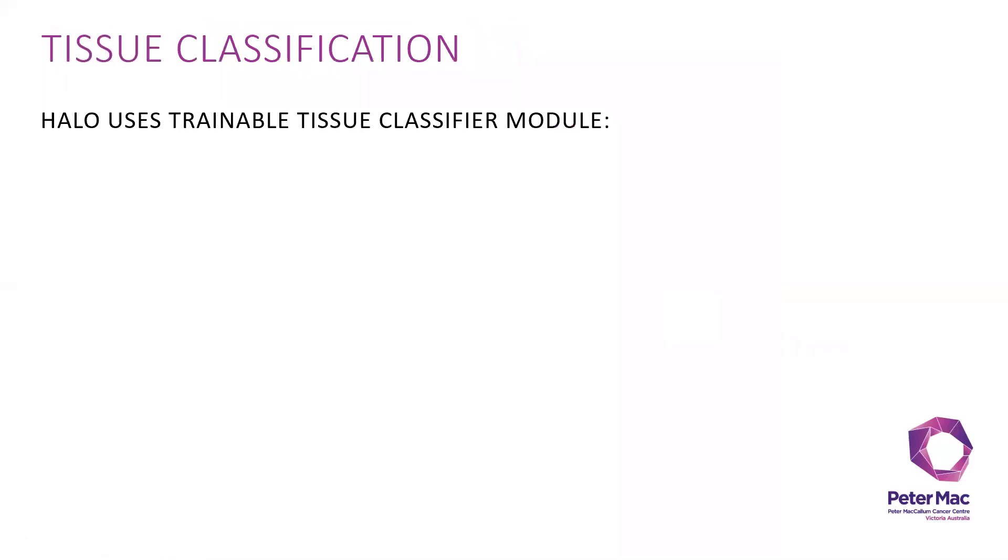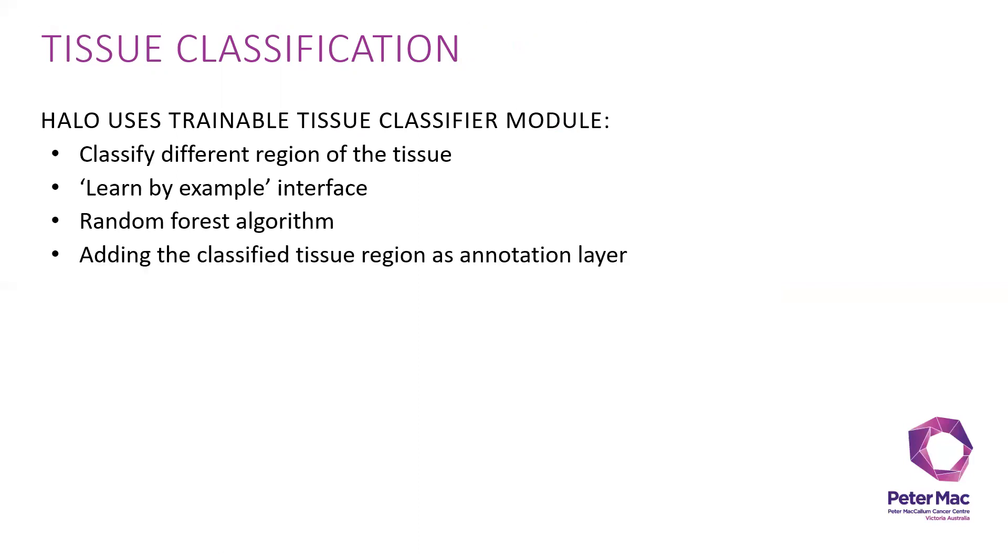You can also use the classification module, which is HALO's trainable tissue classifier. It classifies different regions of the tissue based on the learn by example interface using the random forest algorithm. It can then add the classified tissue region as annotation layer.